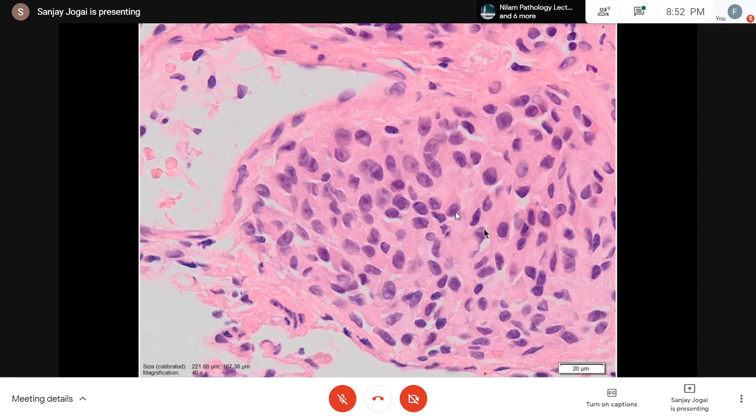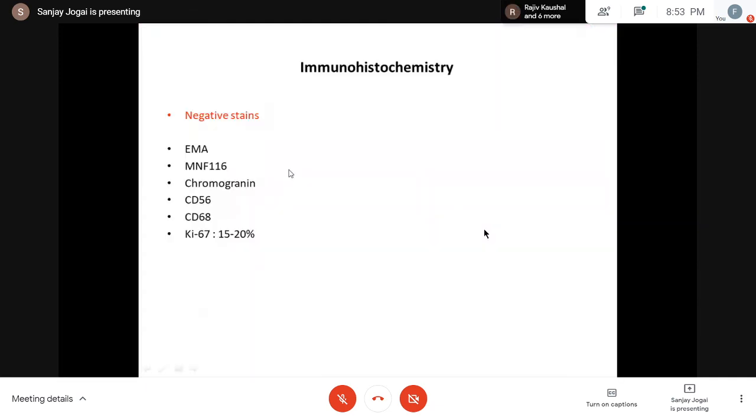Hang on, you said this was query sarcoid, reticulonodular shadowing, but you do your usual immunopanel. So negative stains: epithelial markers negative, chromogranin negative, CD56 negative, histiocyte marker negative, Ki67 was low. Needless to say, lymphoma and everything. It didn't look like a lymphoma at all.